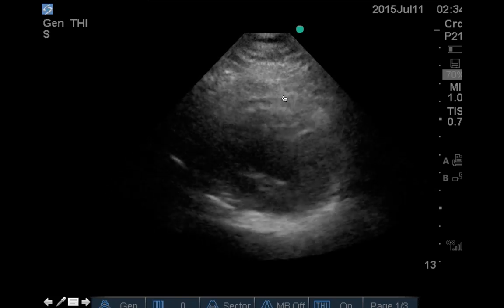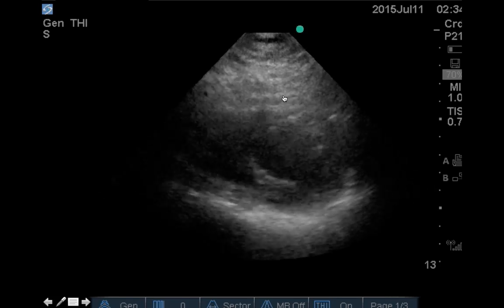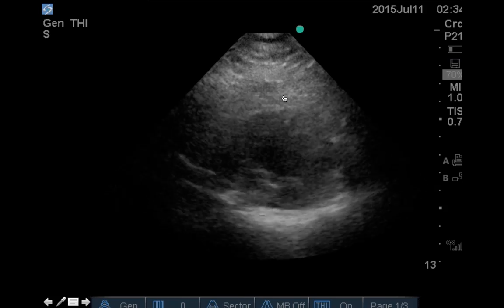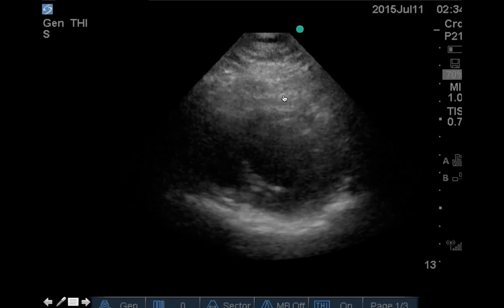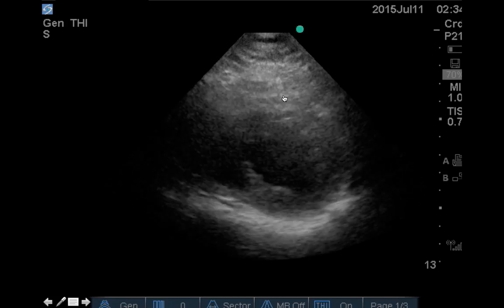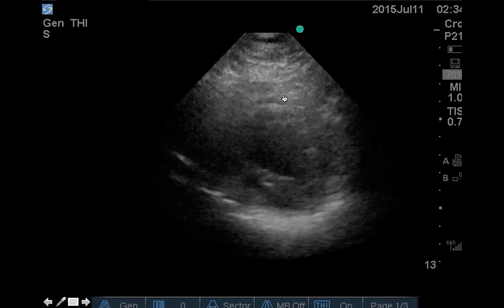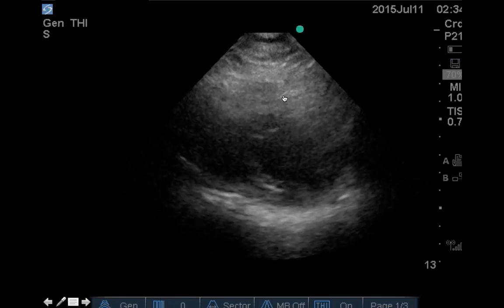This person had a larger body habitus and the image is not perfectly clear, but can you see the pathology? In this parasternal short axis view, you can see that not all portions of the left ventricle are moving equally. If you place a dot in the center, you can estimate which portions are moving less. This patient had a previous LAD lesion and had persistent wall motion abnormalities.